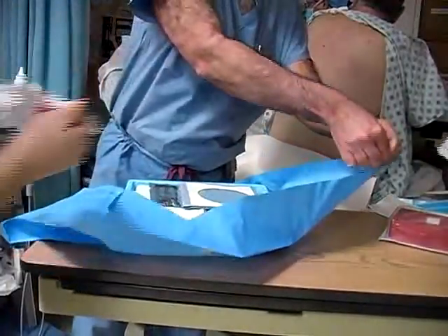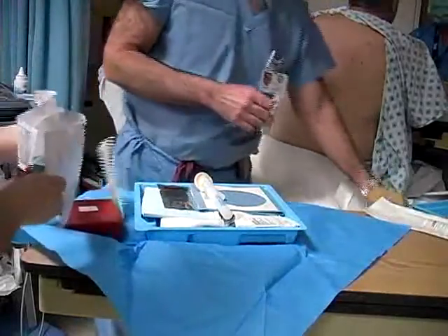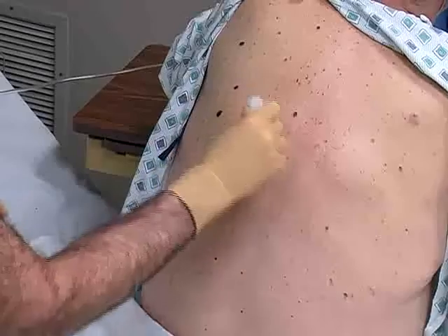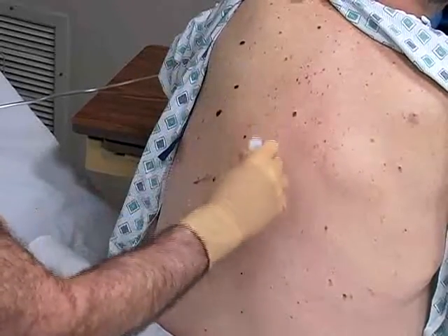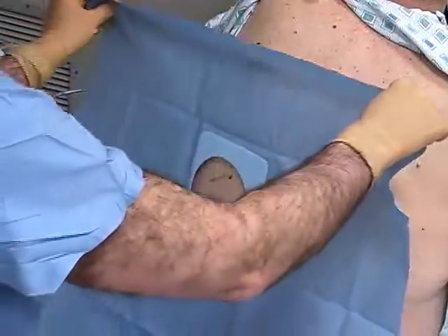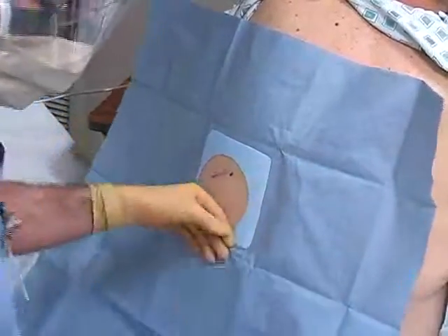Lay out all the equipment on a bedside table and don sterile gloves. Cleanse the skin around the needle entry site with chlorhexidine or povidone iodine, using gradually increasing concentric circles beginning at the needle entry site. Once the area has been prepared, apply a sterile fenestrated drape.